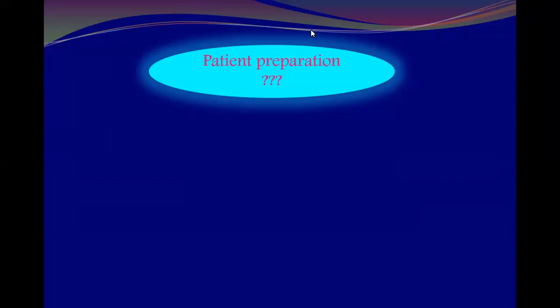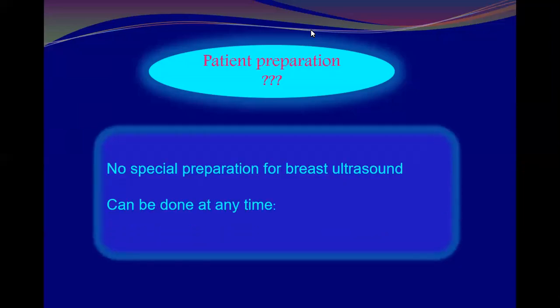Okay, but my question is specifically like for ultrasound of the abdomen, we ask the patient before coming to us to fast. Any preparation for breast ultrasound? All your information is correct, but exactly any preparations you have to do or to make for the patient before coming for breast ultrasound? No, I don't think so. Excellent, well done. No special preparation for breast ultrasound, it can be done at any time. Okay.